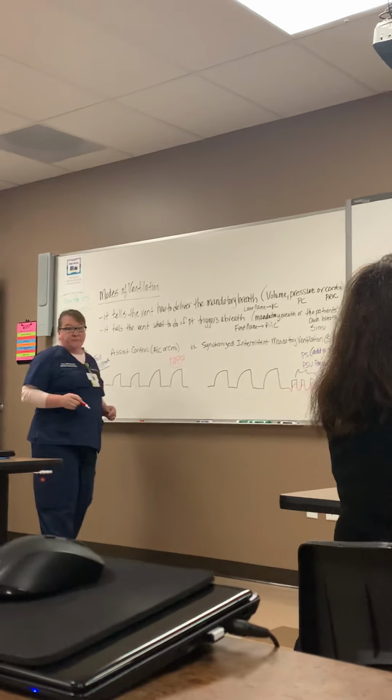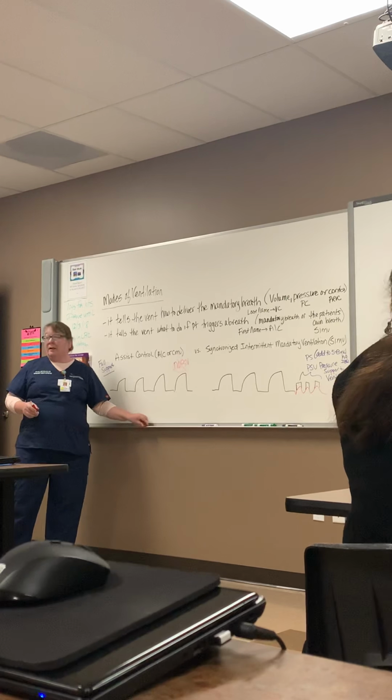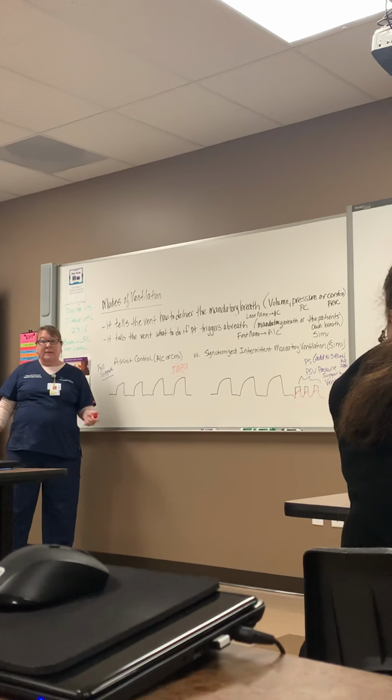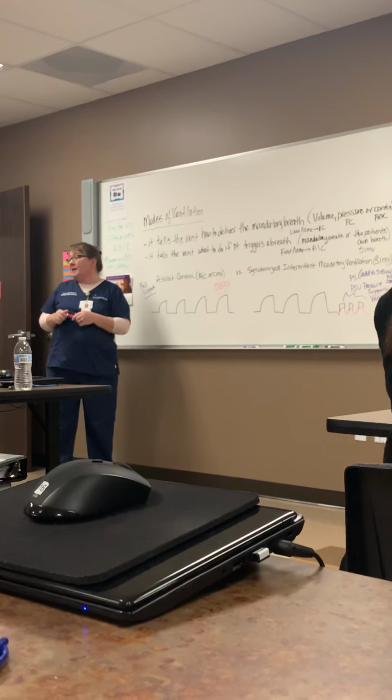Can't do it. And you'll see it on your board sometimes, and you'll also see it in the settings that we're going to give you. We might tell you to put pressure support in AC, and you can't. It's not available.